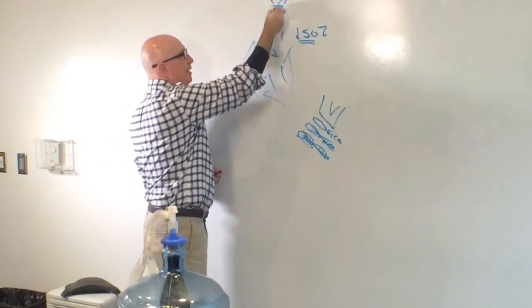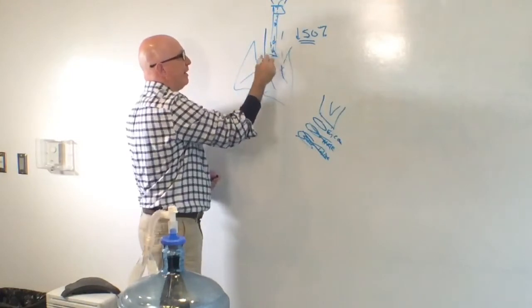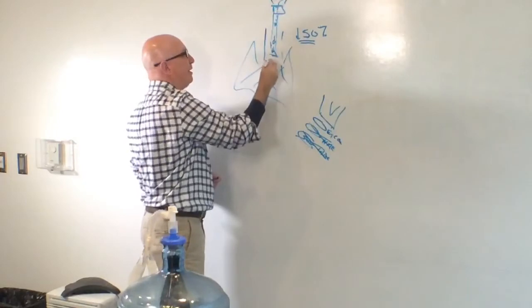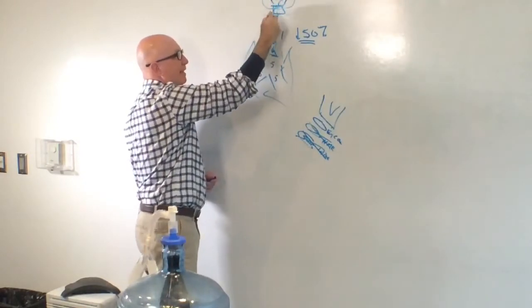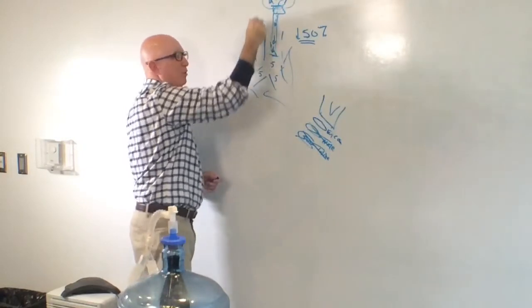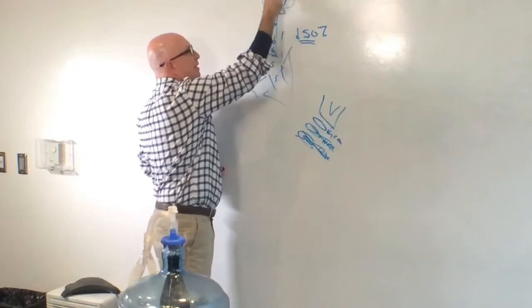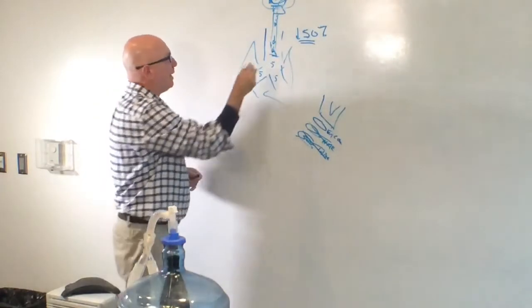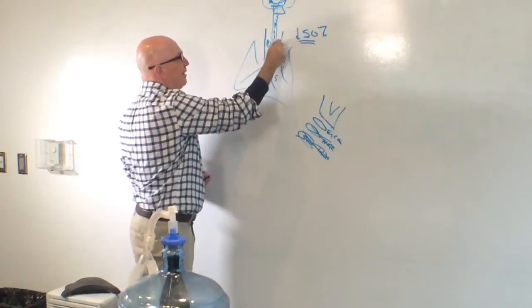During that expiratory phase, there's also gas going down that endotracheal tube trying to stabilize, let's say you have them on a PEEP of 5, trying to ensure that your system stays at a PEEP of 5. But as gas is flowing down here, that pressure would drop if it wasn't for the fact that the machine puts more flow in to make sure this stabilizes at whatever PEEP setting you've set.